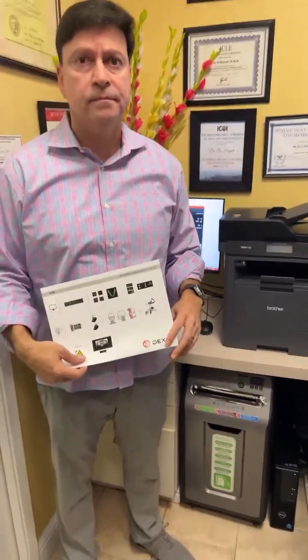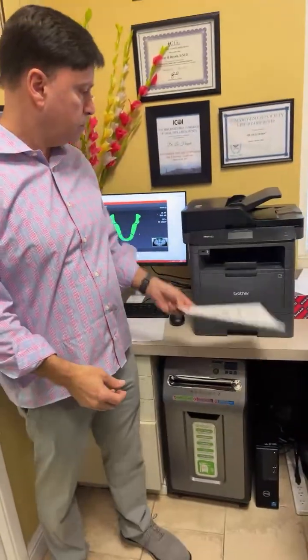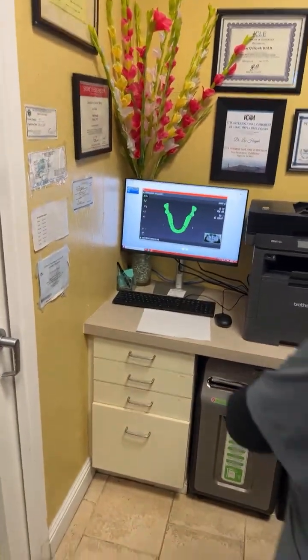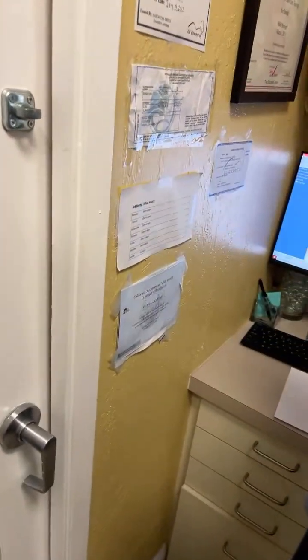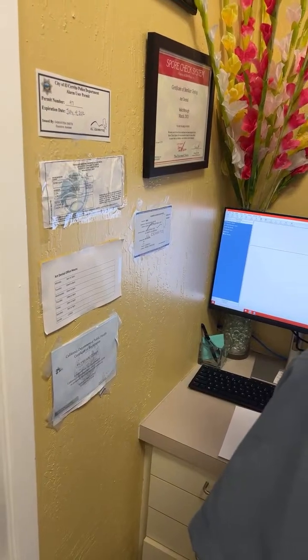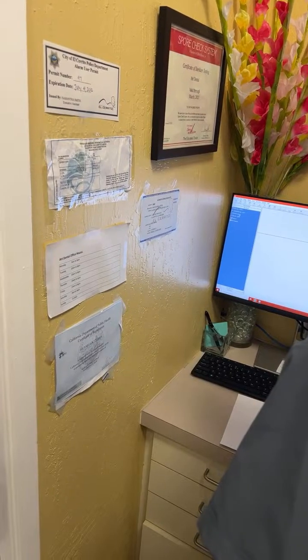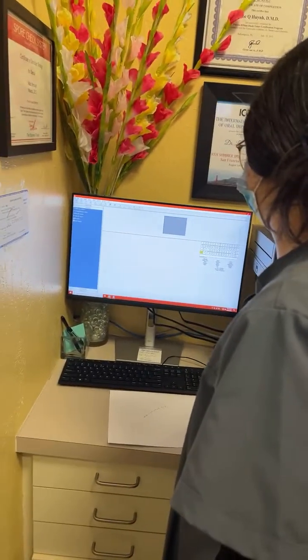Can one of you guys pretend that we're going to do ortho? So I need a pano and I need 3D. Can you try to walk yourself through and see if you can get to where we're supposed to be? The regular pano. I'm going to say okay. I need a pano now. So just close it and say okay. I'm ready for pano. So we select the patient and then pano. Exit out. Exit out, because that's one already.